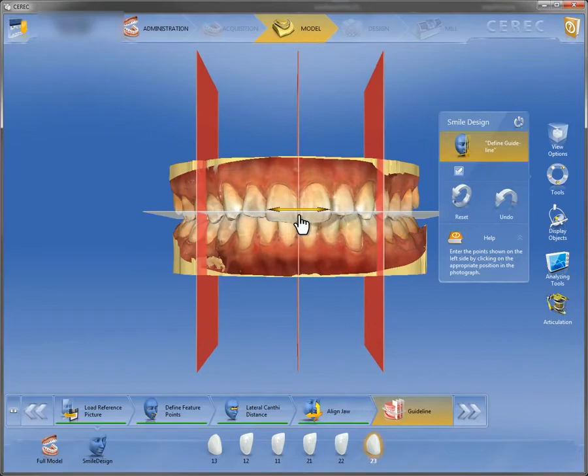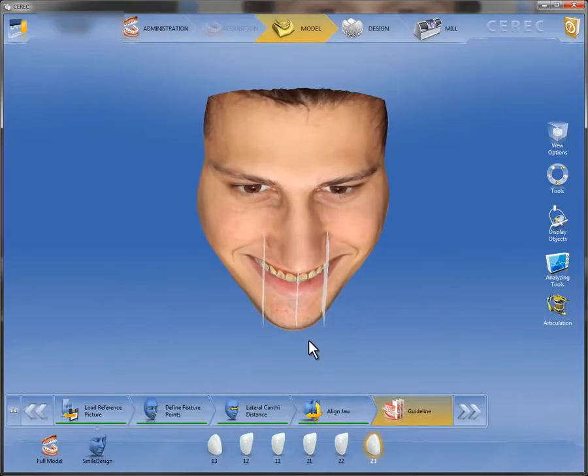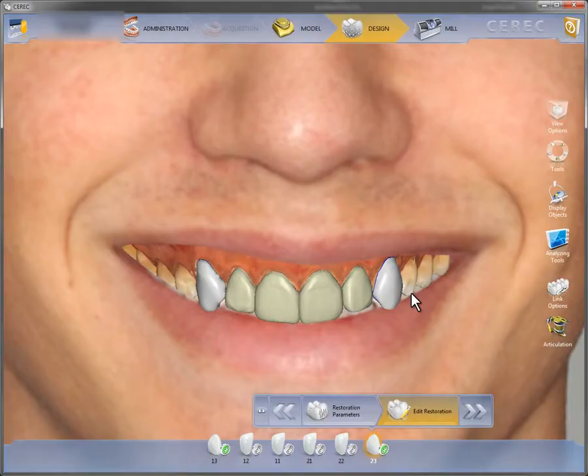The fact that the orientation planes are shown also makes it easier to align the model properly. Once the model is aligned, it can be constructed and changed as normal in CEREC.